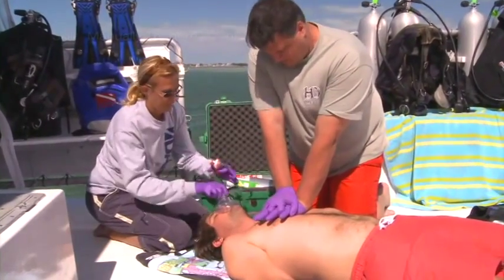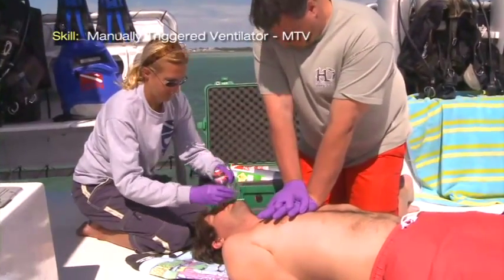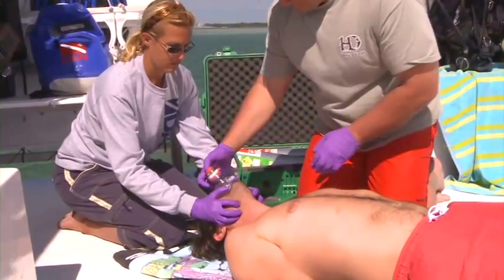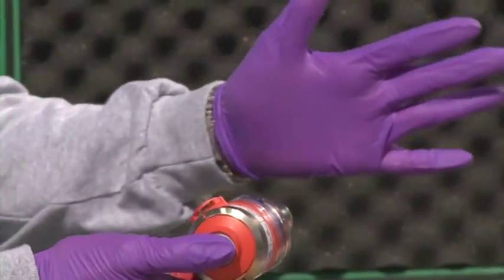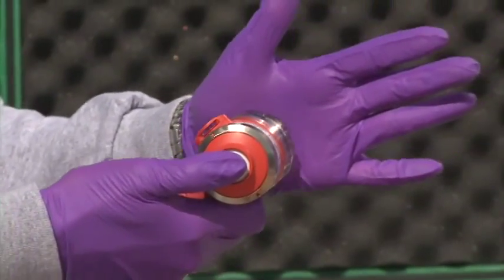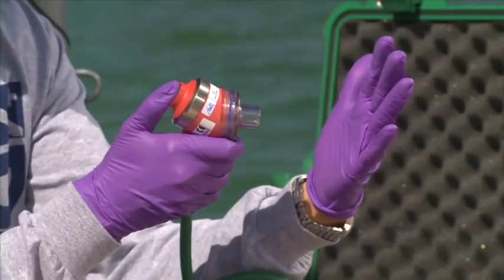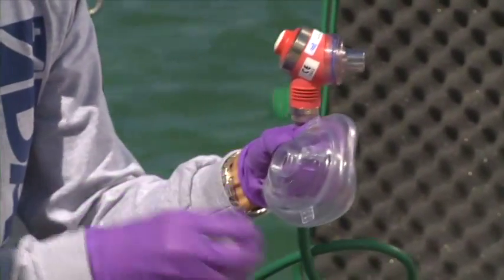Never delay care while waiting for a manually triggered ventilator or preparing to use it. Perform CPR using a resuscitation mask while another provider sets up the MTV. Depress the button on the device to ensure oxygen is flowing. Verify the safety mechanism is functioning by sealing the device against your hand and depressing the button — the oxygen flow should stop and the gas should be released.